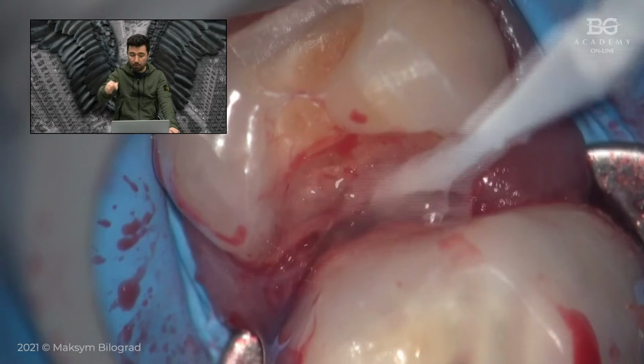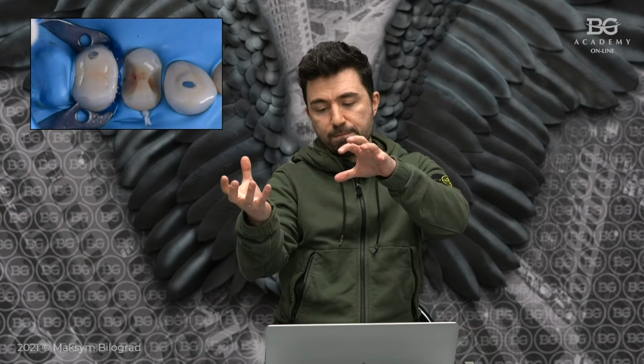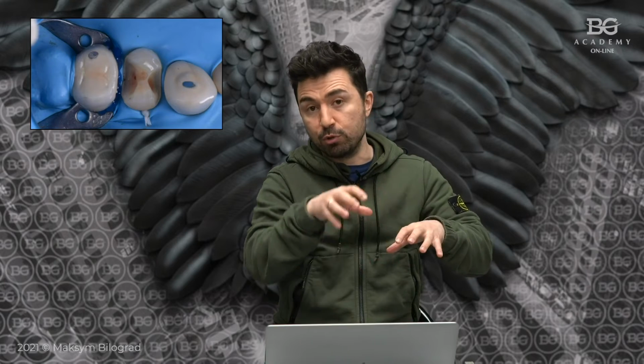You see that we have enamel, by the way. That is important for restoration. Then I put some hemostatic liquid. I prefer to use Viscostat Clear. Then we bring back our rubber dam to its own places.